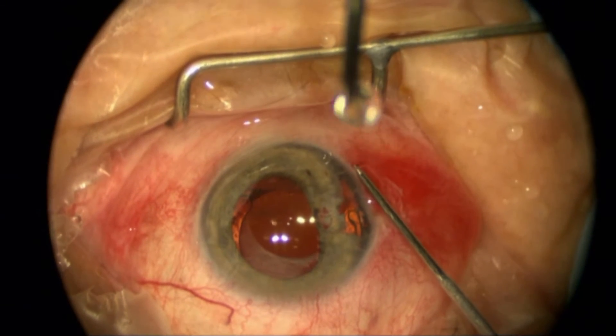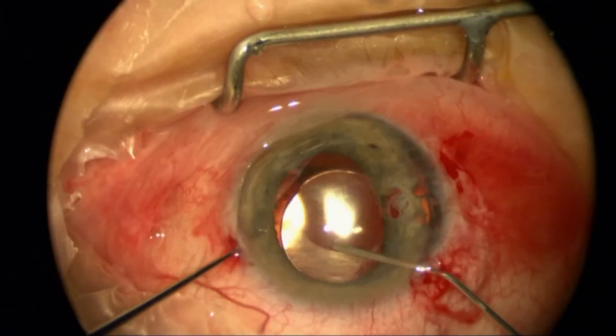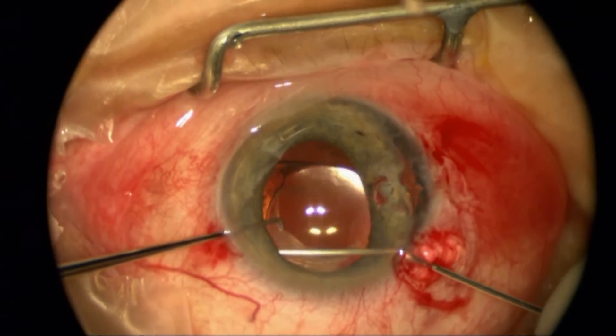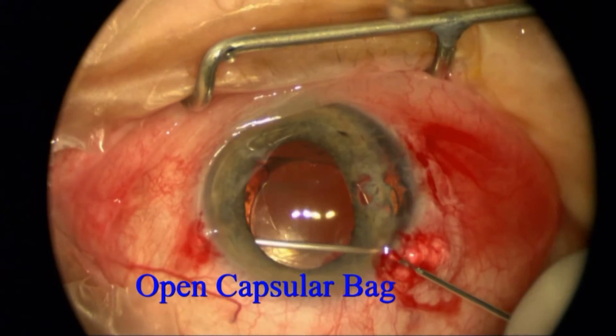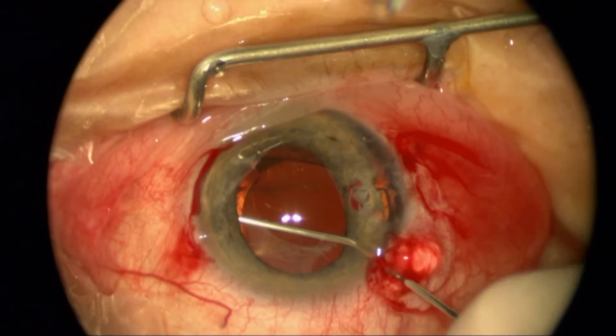I don't want to have a recurrence of much inflammation and scarring, so I'm creating paracentesis ports here. I'm going to use a cohesive viscoelastic to open up the capsular bag. You can see the optic — one loop is in the bag with the other loop in the sulcus.